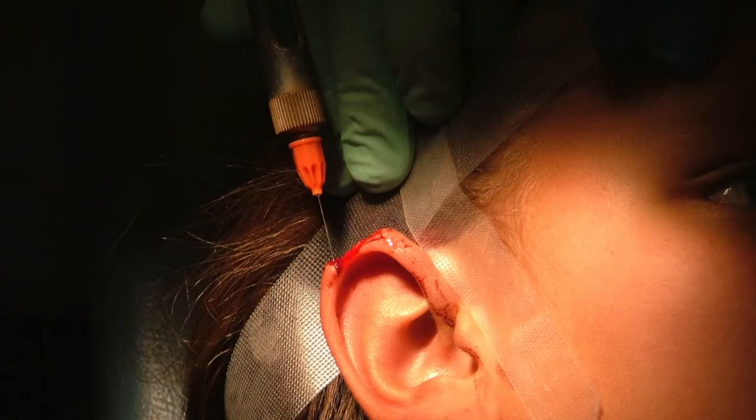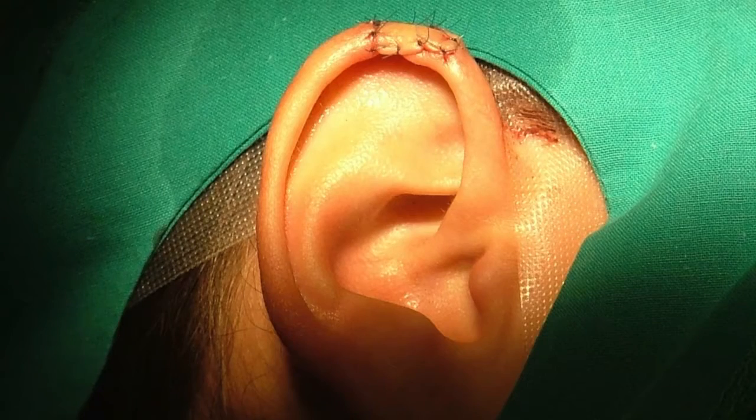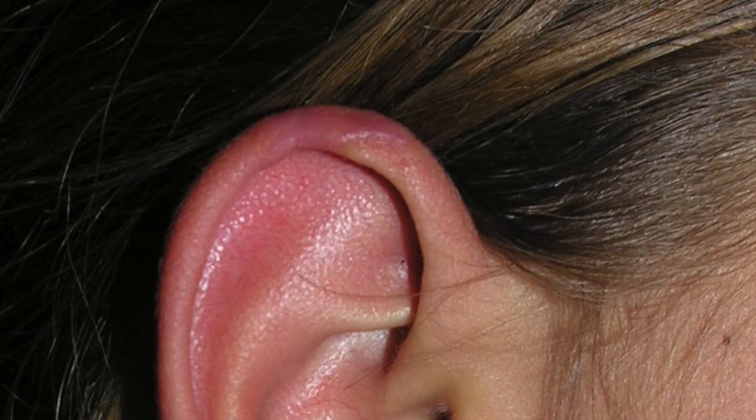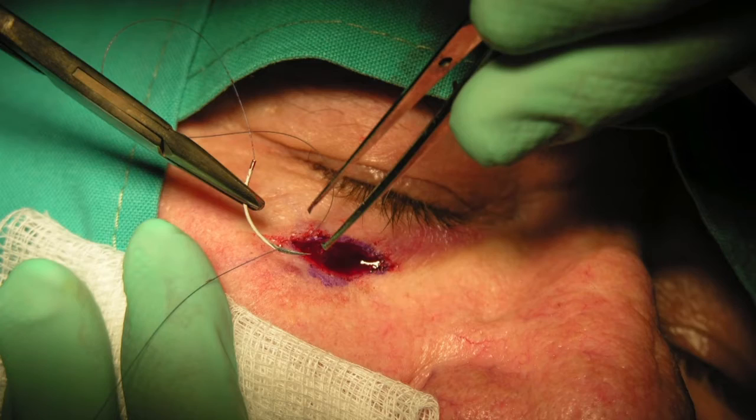Suturing students in the various fields of medicine are preparing to suture lacerations in real patients and thus want to experience a reasonable amount of realism when practicing suturing skills.